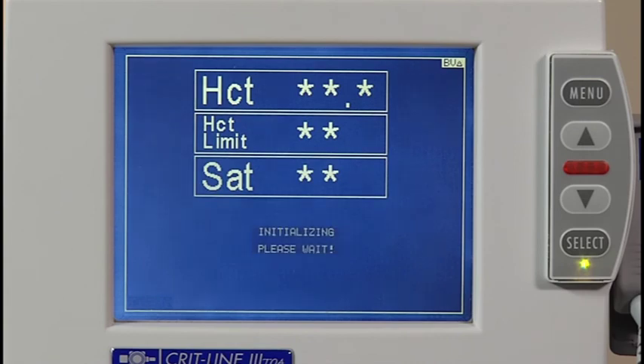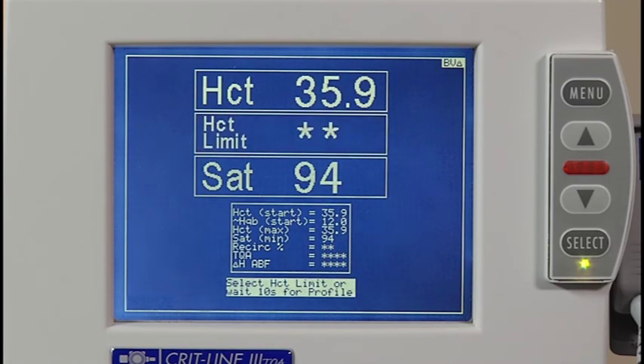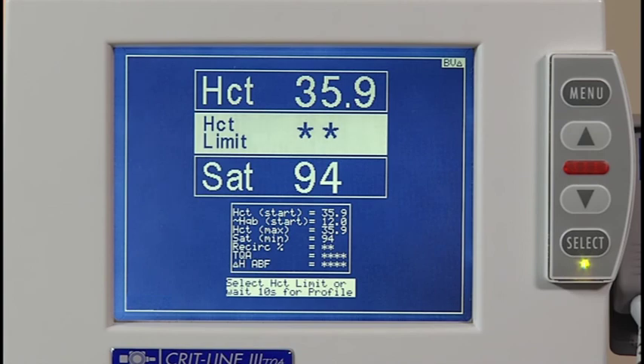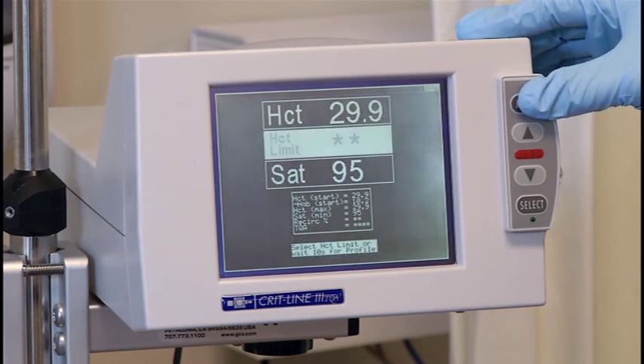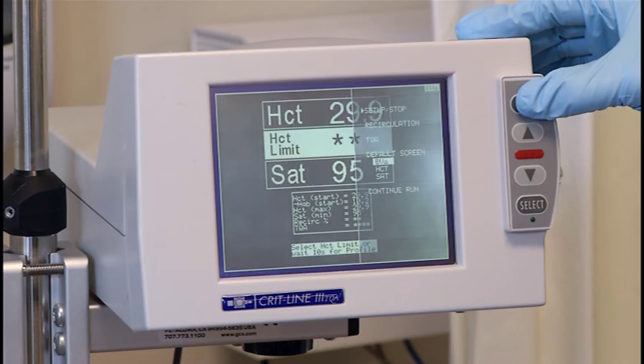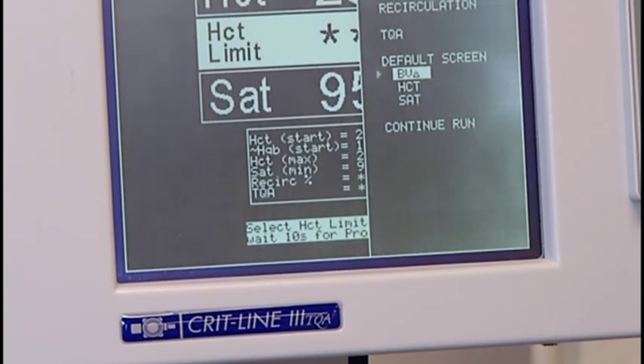The startup screen can be accessed at any time during the treatment by pressing the menu button one time. The startup screen will appear for 10 seconds before returning to the blood volume screen. This screen is used to enter a hematocrit limit and also to remind you of the patient's beginning hematocrit and hemoglobin. You can also use this screen to see the maximum hematocrit measured during the treatment as well as the lowest oxygen saturation measured. If you push the menu button while still in the startup screen, you will get to what is called the split startup screen. From this screen, you can change the default profile screen from percent change in blood volume to hematocrit or oxygen saturation. Just move the cursor until it is next to the default screen of choice and press the select button.